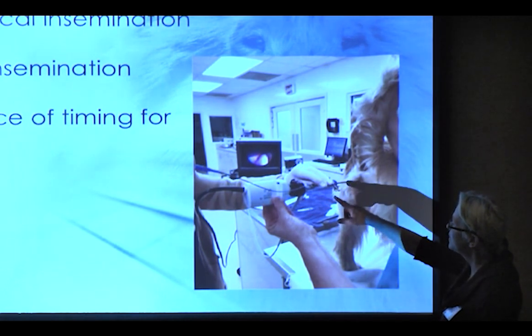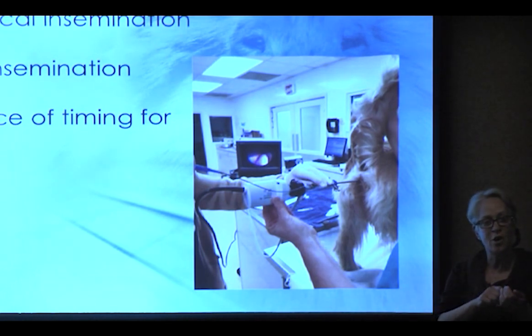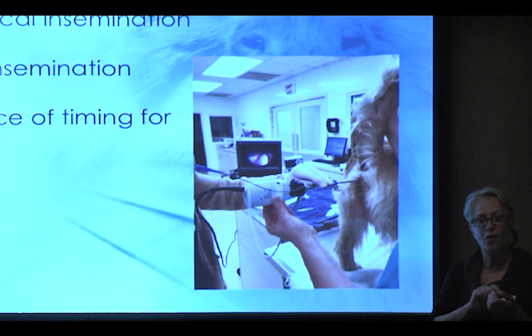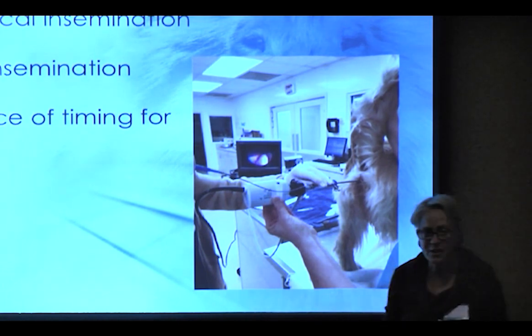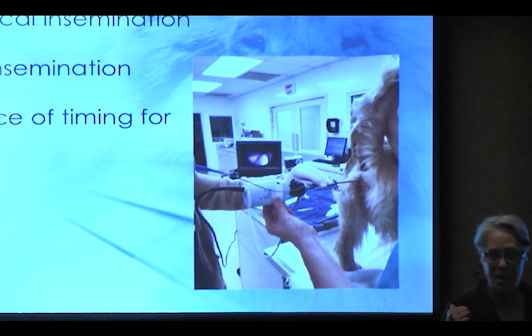But this is what we have. This is an endoscope, and we actually put it up into the dog's vagina, and you'll get to see a little video, into the dog's vagina, all the way up to the cervix that looks like a rotten egg. And if you just do your timing by vaginoscopy, you actually can time a bitch by vaginoscopy.